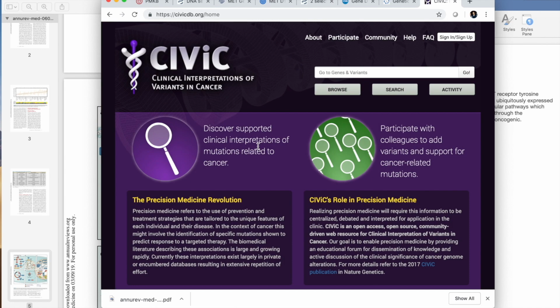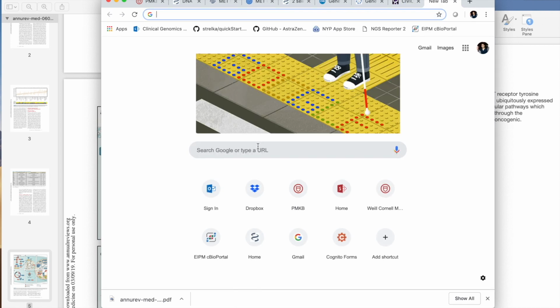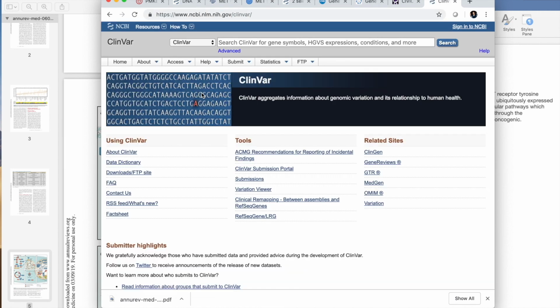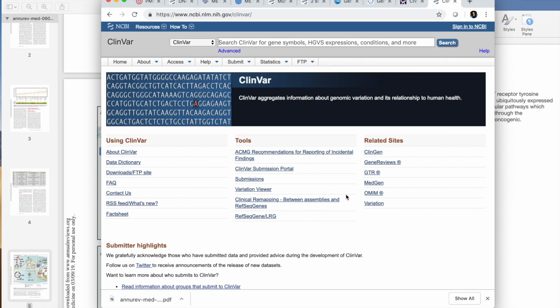And of course, there's always the literature that you can find through PubMed. Now for many Tier 3 variants, which we're not really covering in this video, the variants may be germline, and so a great resource to look at is ClinVar. Okay. Next, we can start looking at the information regarding prevalence and prognostic and therapeutic significance for these gene variants.